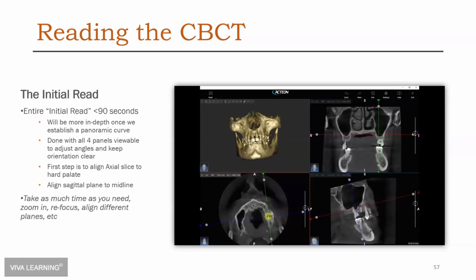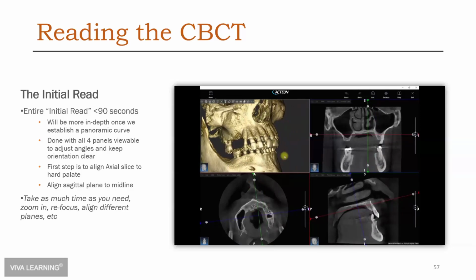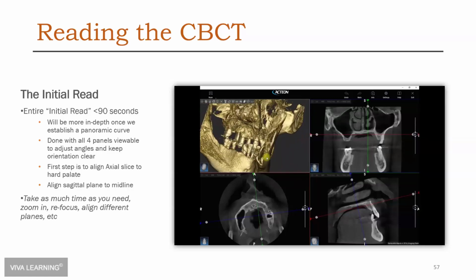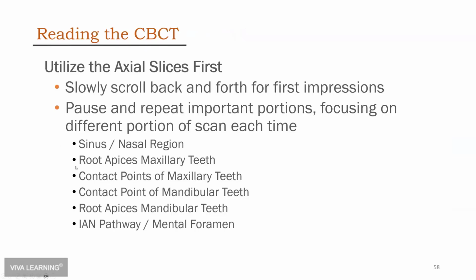And then lastly, you can certainly look at the 3D rendering if you want to look at the gross anatomy, you know, where the mental foramen and infraorbital foramen are, some large defects, tori we can see there, greater palatine foramen, etc. Okay. So I would say on average, once you get good at this, about 1 to 2 minutes would be enough for you to quickly gauge what we're looking at when we're walking into the room to meet the patient.